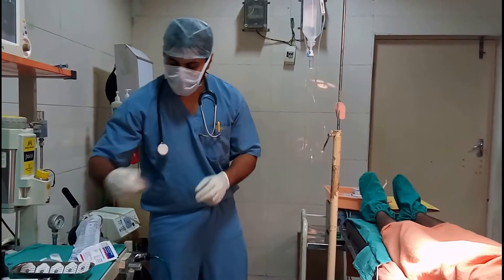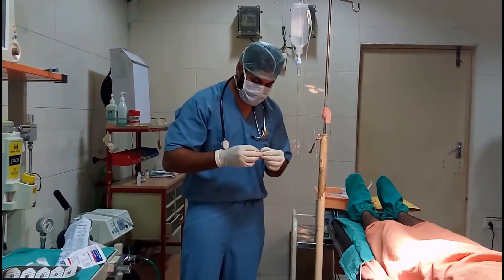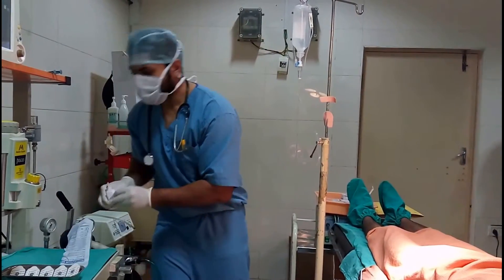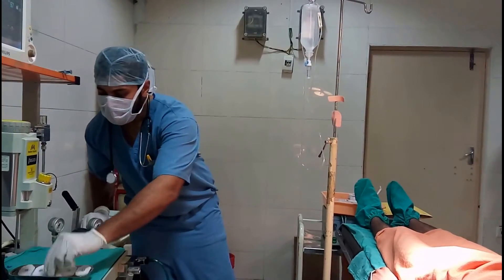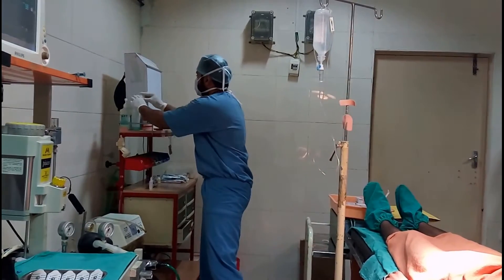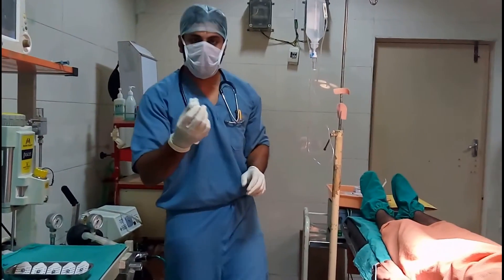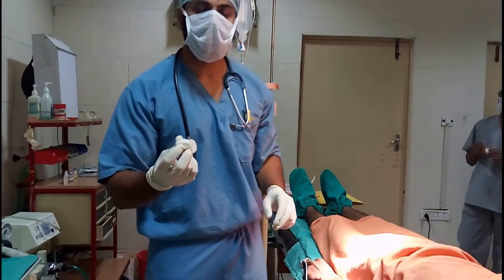It's always nice to prepare yourself ahead of time so you don't have dependency on others. Keep your workstation clean. You need a swab which is soaked in isopropyl alcohol.